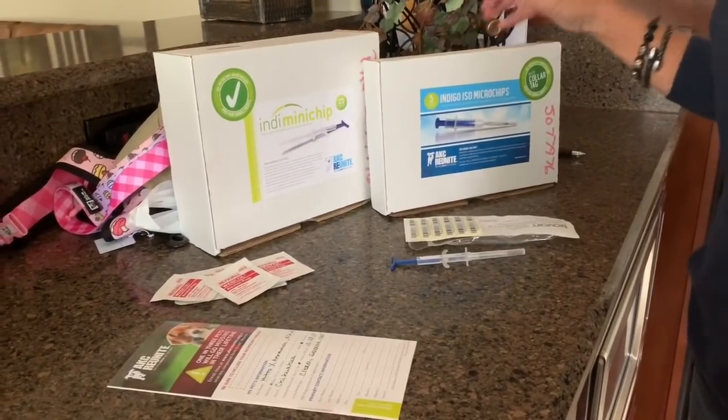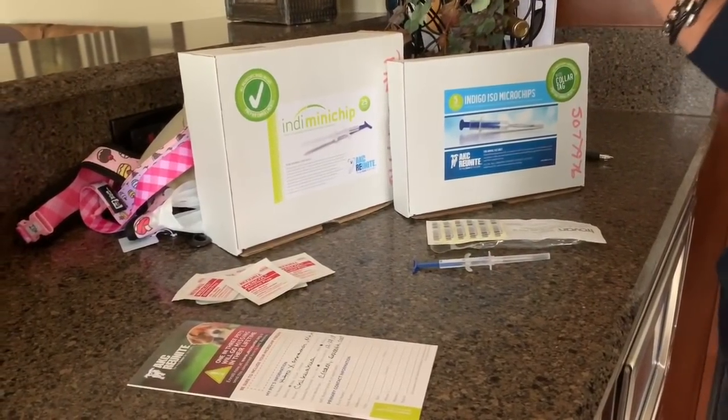Today we're going to microchip our eight-week-old puppy. There's only one in the litter, so we only have to do this once.